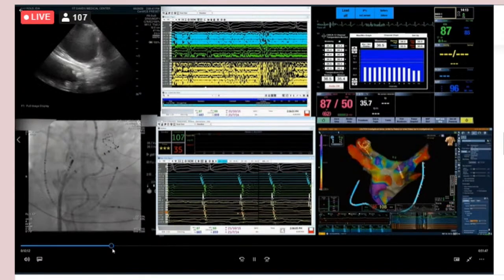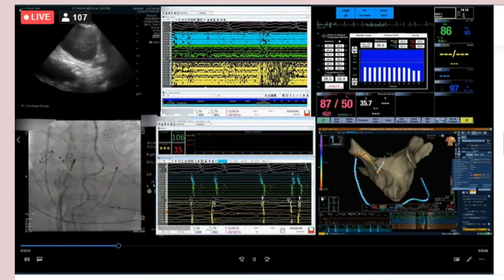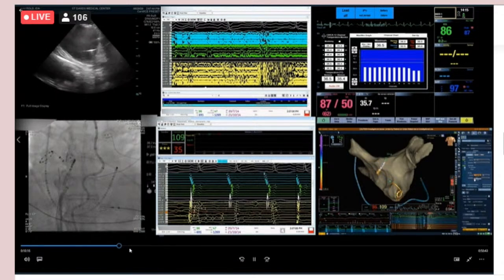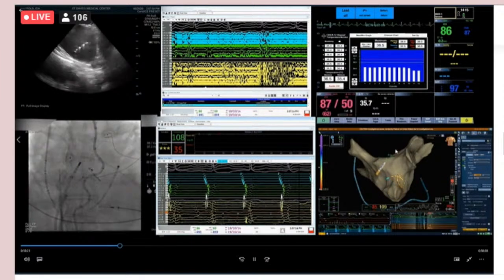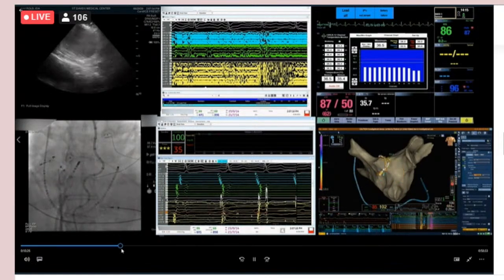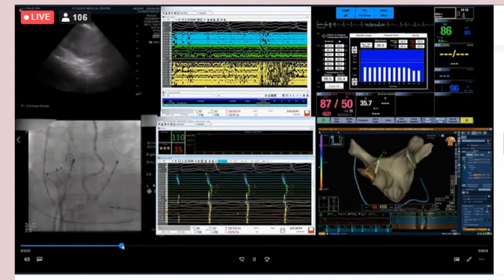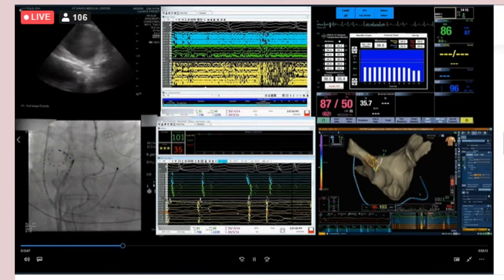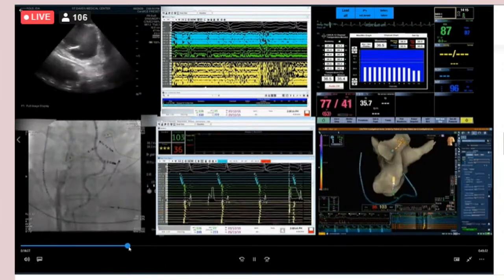Okay, so there's the map, and it actually has some other nice features. They did some nice things to the way they display it. So now you can get a pressure that shows up on your map. So it actually is nice. I don't think they may have an arrow. I think they may also introduce an arrow with this version, which kind of helps you when you're trying to point the anterior, also, or at least I think that's what's going to happen. Go ahead and forward to some ablation.